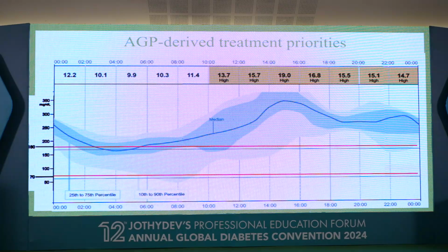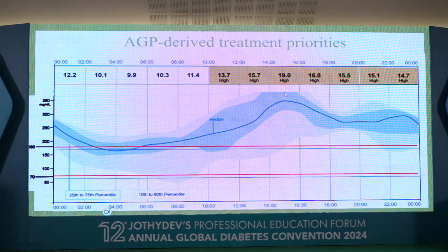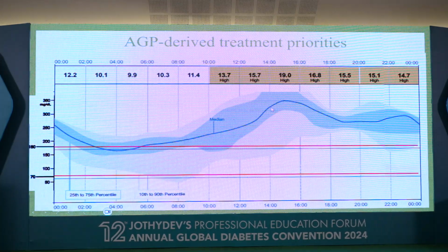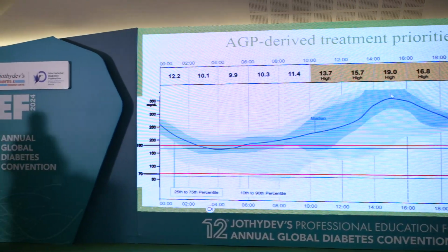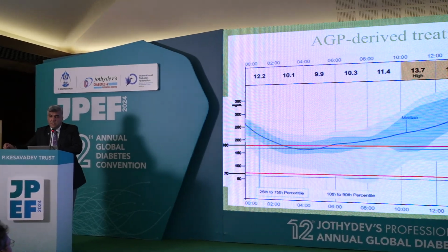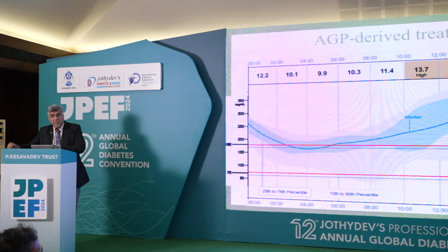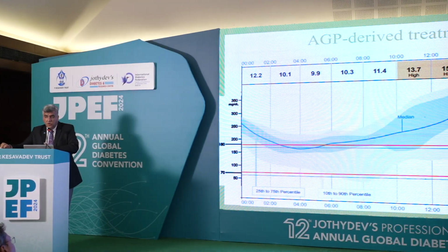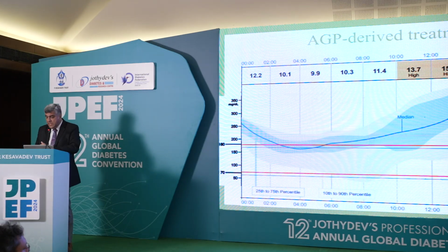Now when your patient has a profile like this, I can see that the patient's sugars are at 350, 400. A simple question to any of you. Based on this report, shall I go ahead and increase the dose of insulin or tablets because this patient is touching 350 and above? Should that be my approach for such a patient? Come on, somebody help me out. You're looking at such severe hyperglycemia. Shall we not increase the dose of medicine or insulin or whatever? No? Yes. Okay.